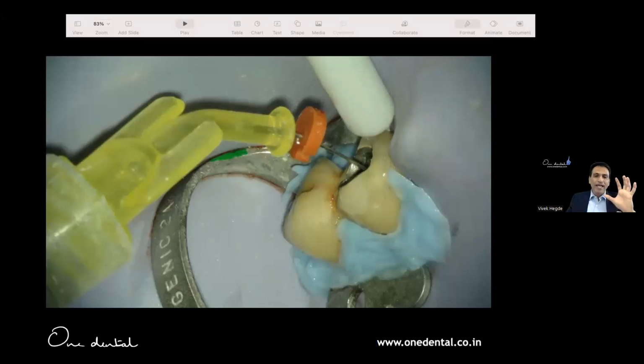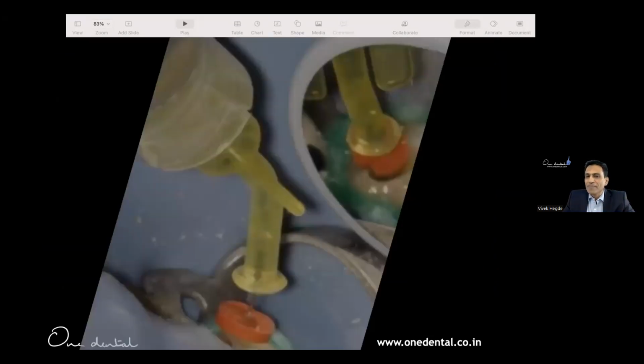If you don't have that, use any system, any needle, any syringe, a Luer lock one again with the stopper. Stopper becomes a big reference point in endodontics for all of us because we don't know how far the other end is. I know we have apex locators, working length with radiographs and combinations and whatnot. But this is a wrong picture. This is actually my own picture. I purposely made it. You know what I'd say? If there's a stopper, why not adjust the stopper to this level? Now you see this.